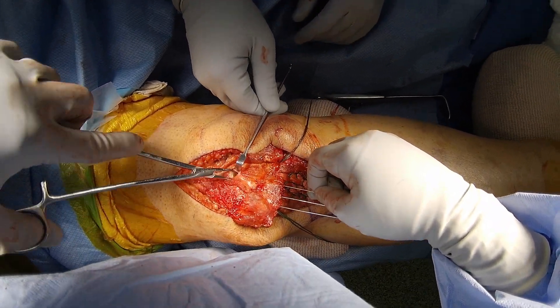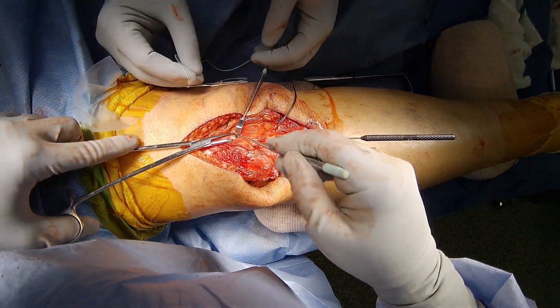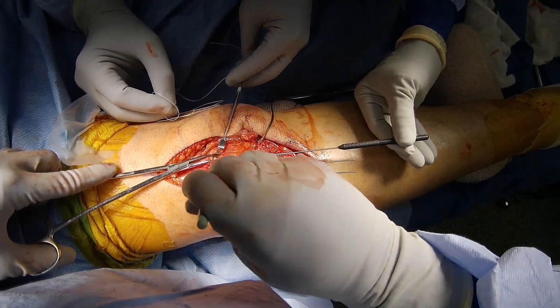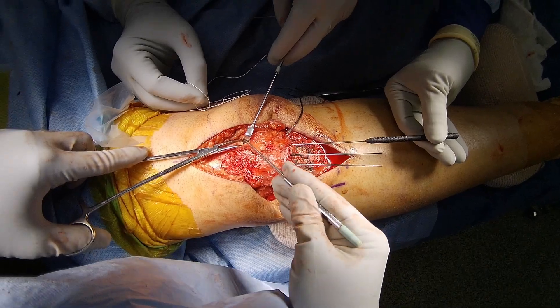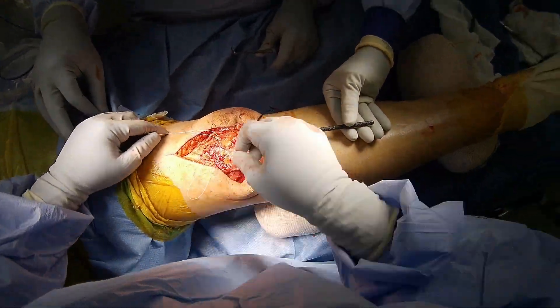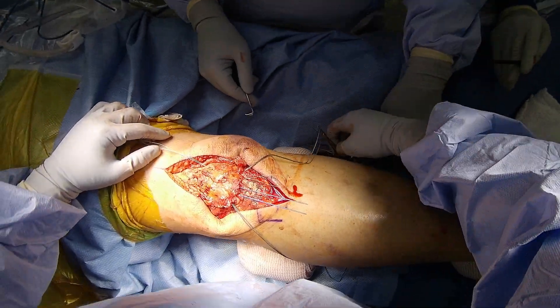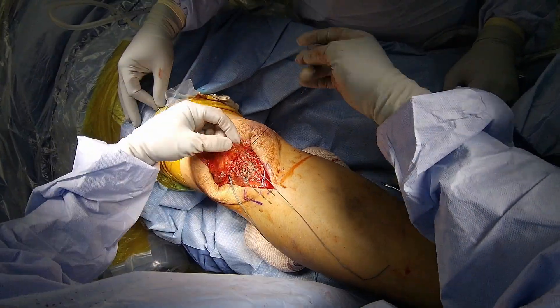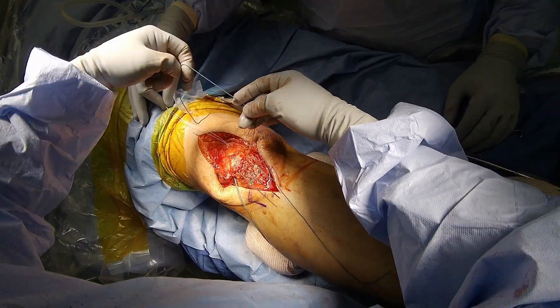If you can access the drill hole proximally with the Hewson, that is easier, but in this case I could not find the hole under the quad tendon, and so went from the exposed part of the tendon and pulled the Hewson strings proximally and retrieved a second suture, which I then used to pull the tendon sutures proximally. This is the most medial patella hole, so I ensure I have the most medial patellar tendon suture and shuttle it through the hole.